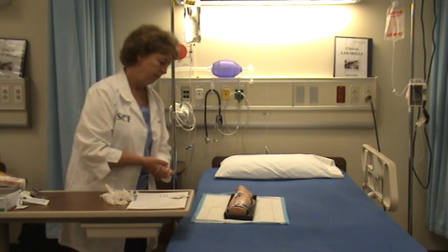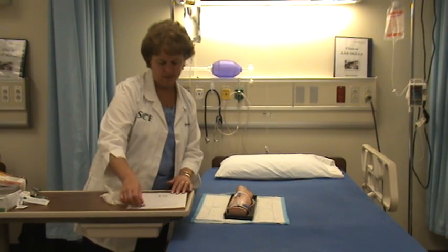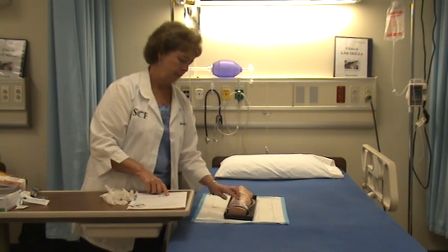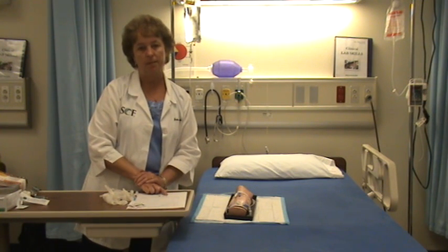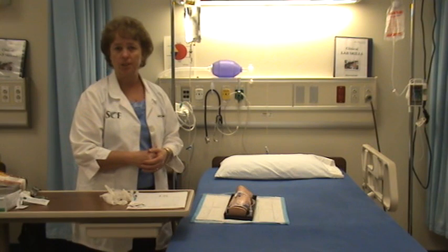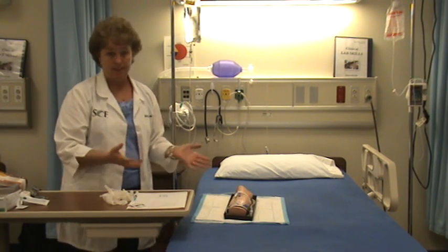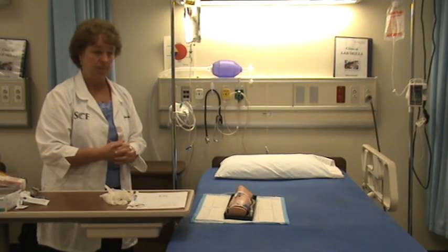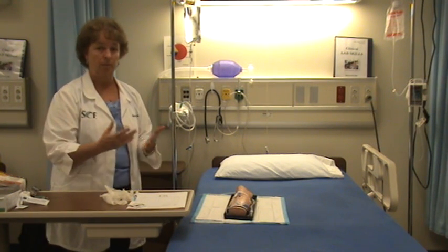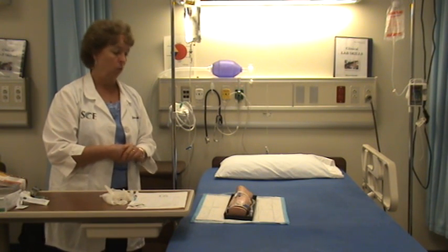I use two identifiers: the patient's name is Criss-Cross, and the date of birth is August 7th, 1925 — the same as on the MAR. I also do any necessary patient teaching. Since the patient is getting IV Lasix, if he doesn't have a Foley catheter, I make sure he has a urinal or bedpan nearby for when he needs to urinate.